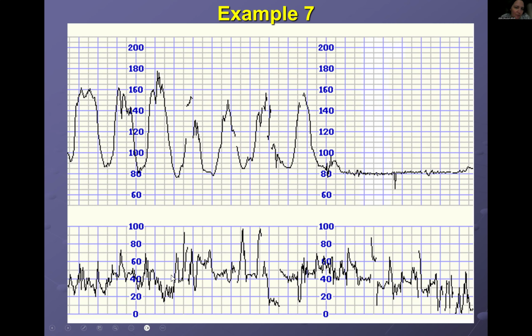But even though it doesn't look good there, or at least let's say there's loss of contact or whatever, here you can see that the baseline is not normal. Here the baseline is 90, all right, 80, and 75.